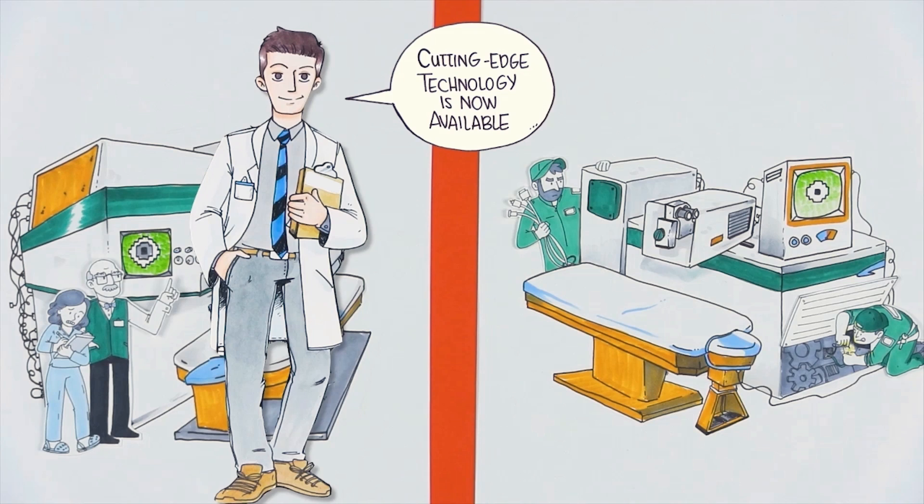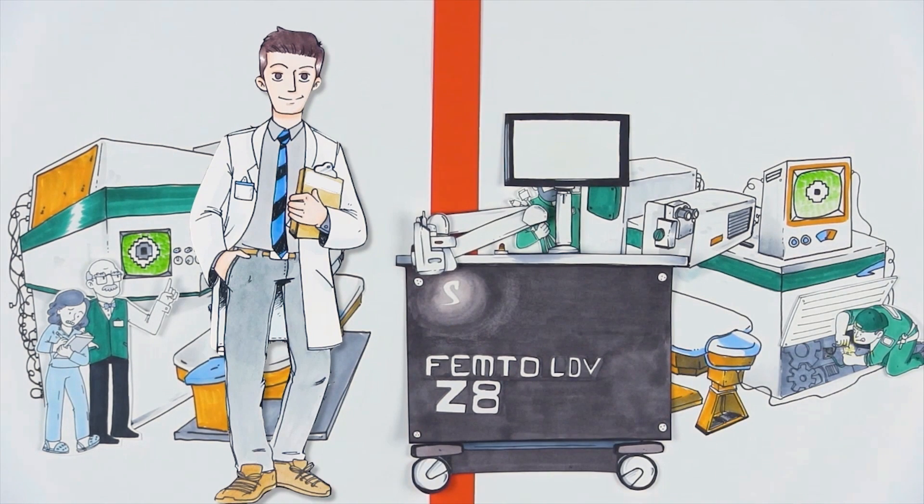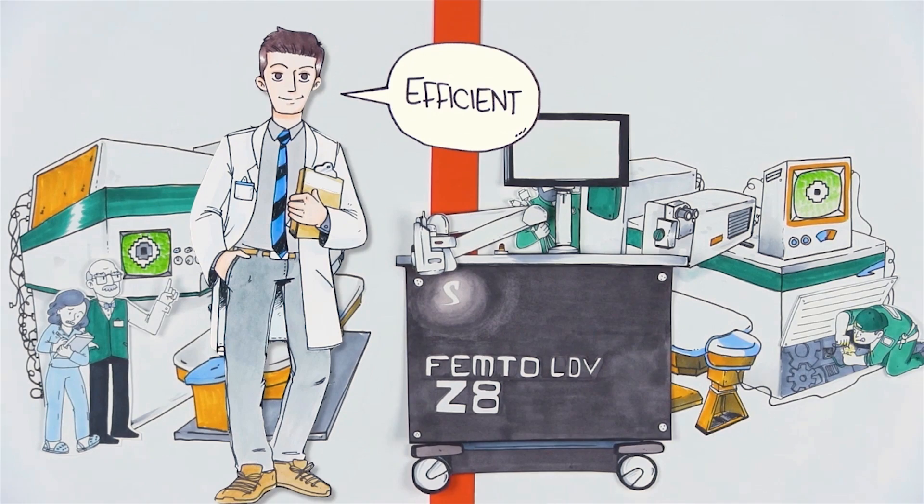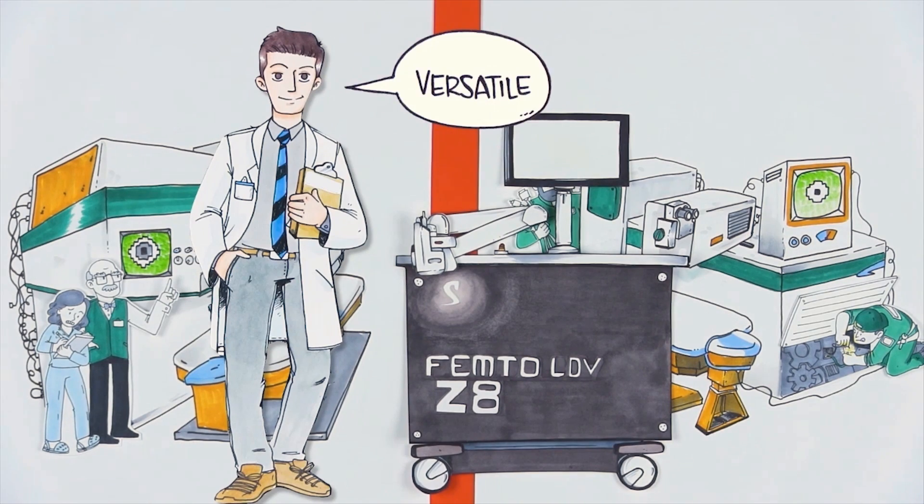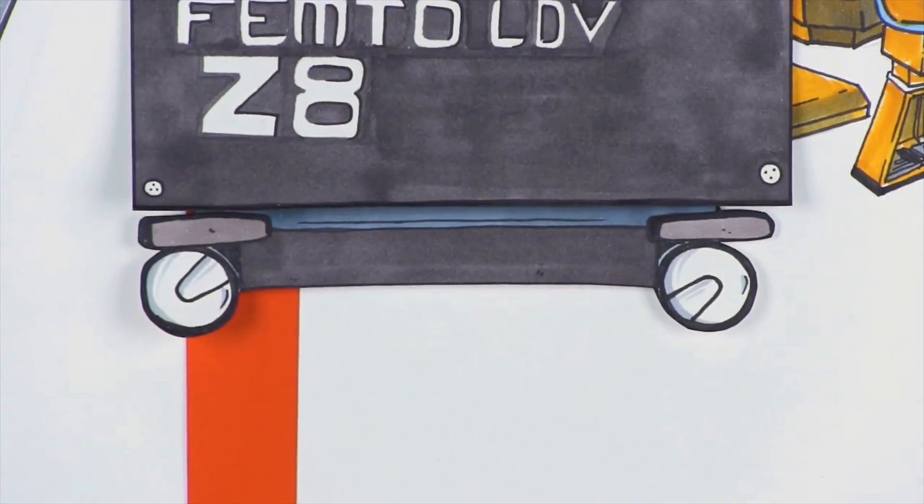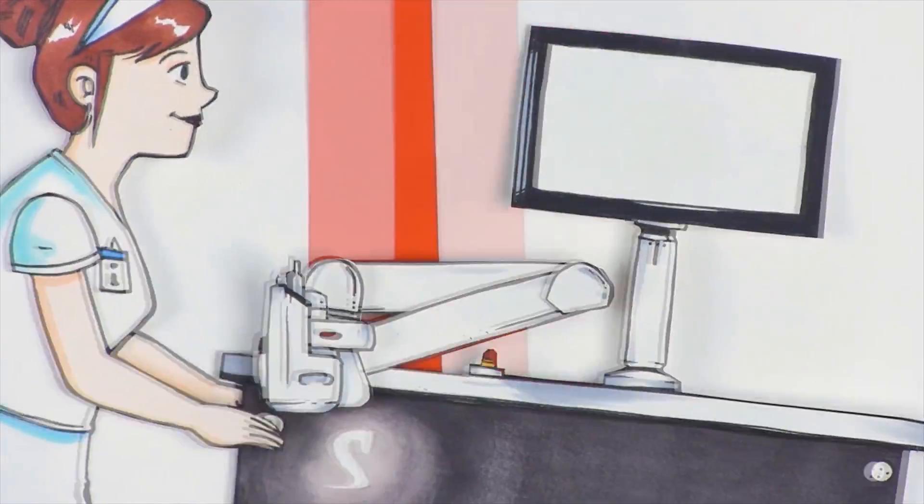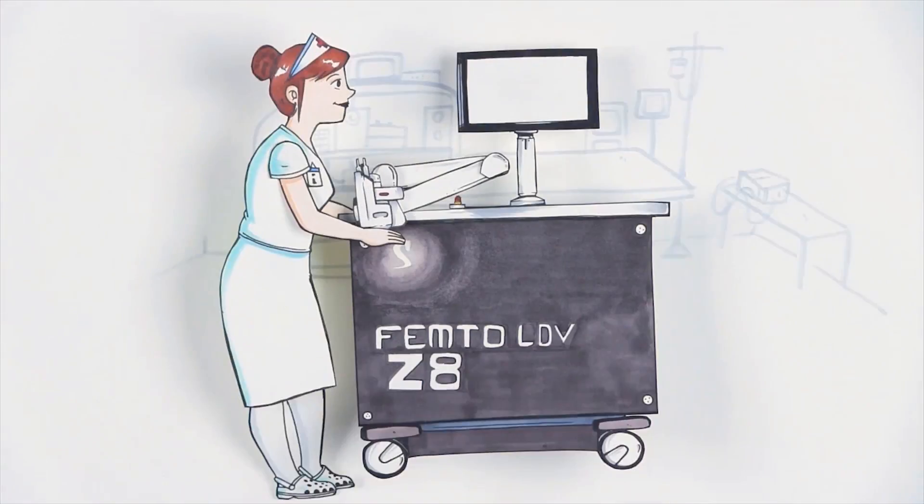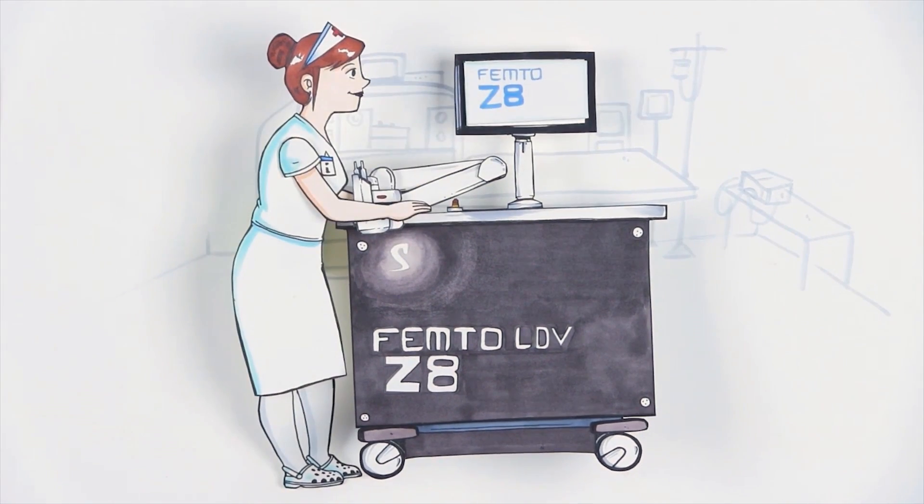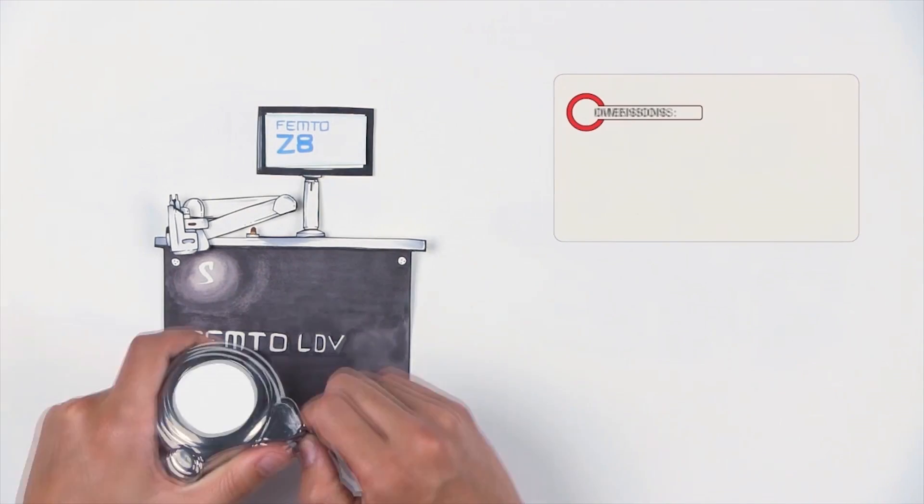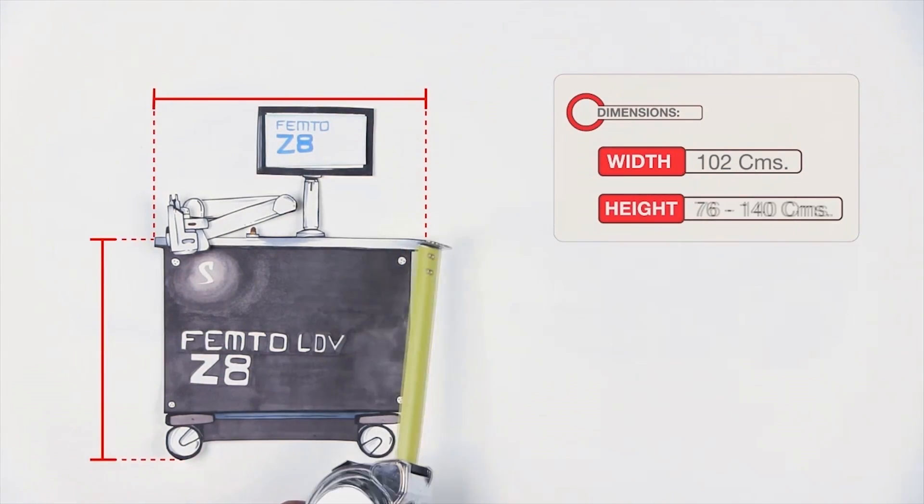This is the Femto LDV Z8, a mobile, efficient, and versatile femtosecond laser by Ziemer. It's mobile because of the compact design and its wheels that allow moving across rooms and clinics. No installation, no alignment, no calibration, and no need for engineers. It's efficient because its design saves time and space.